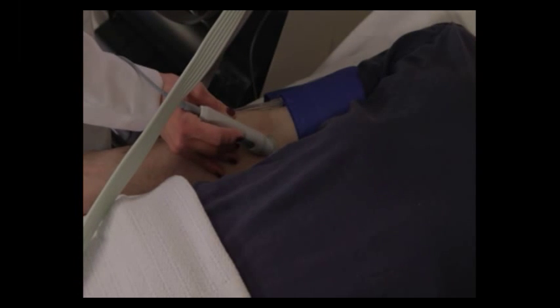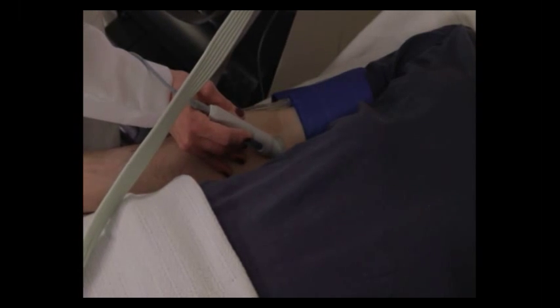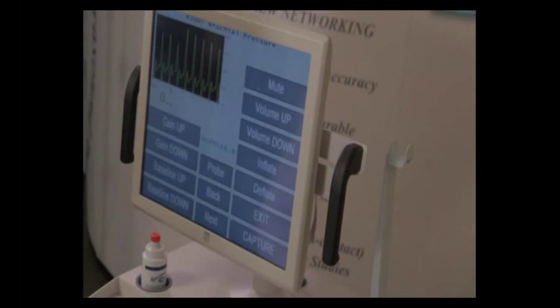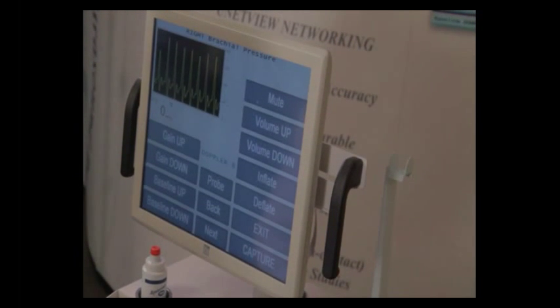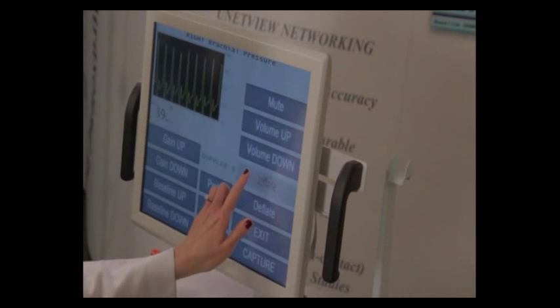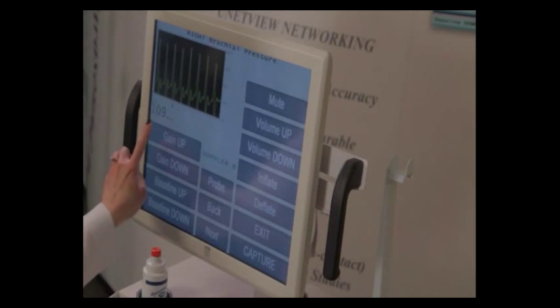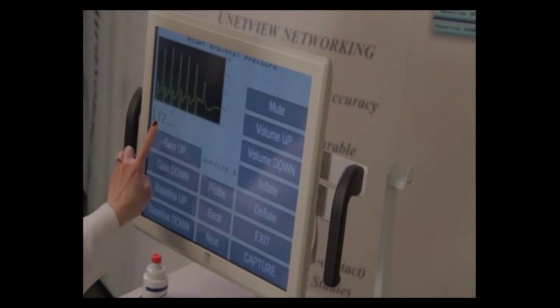You hear the signal getting louder. Keep moving slowly towards the body until the signal gets quieter, and then move back to the center where the signal is the loudest. This is a very nice signal, so we're going to now press the inflate button one time, and you can see the pressure on the screen going up.